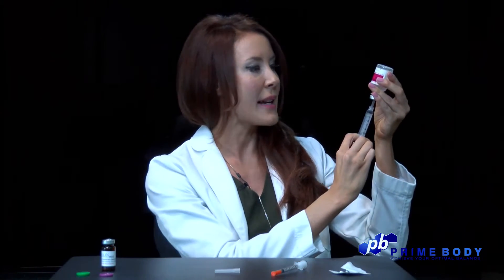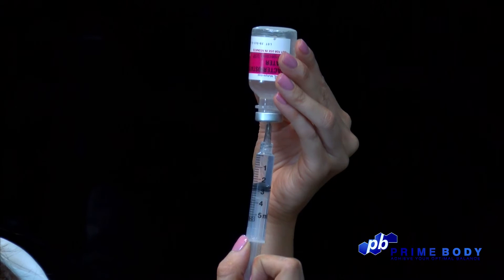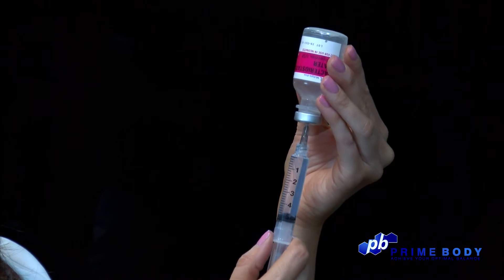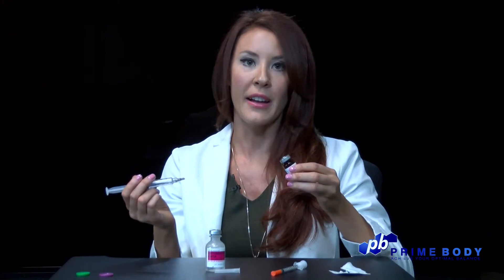Turn the vial upside down and withdraw 5 milliliters of bacteriostatic water, using the top of the plunger as your guide. Remove the syringe and inject the entire 5 milliliters into your vial of HCG.